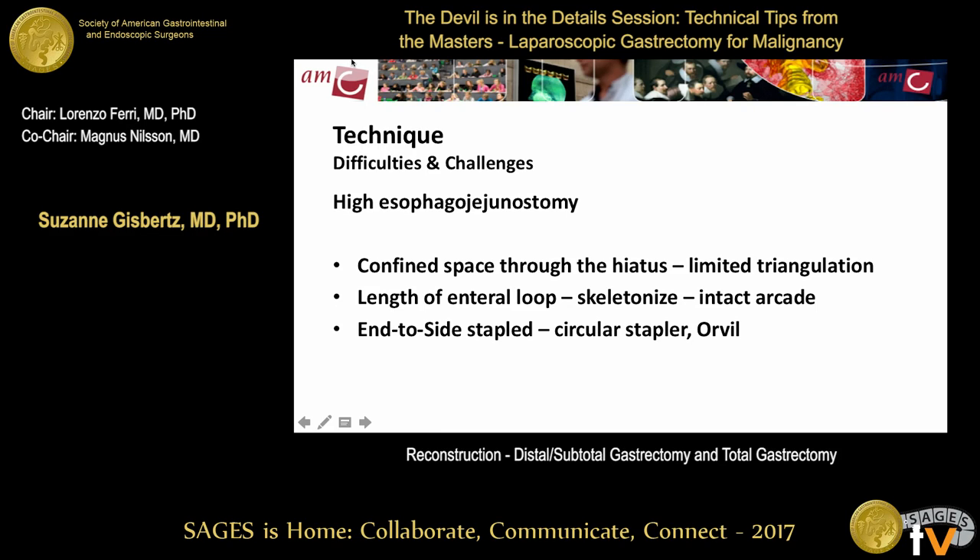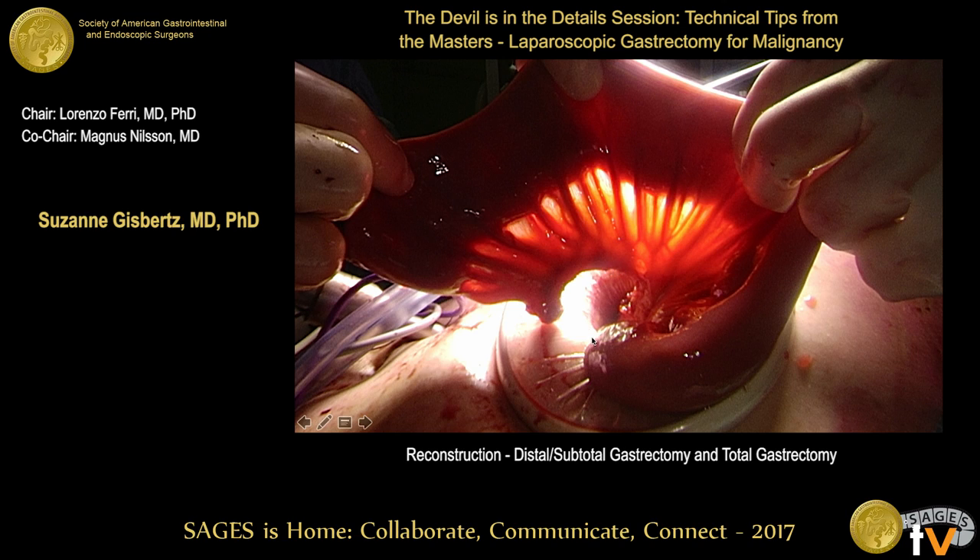For really high esophagojejunostomies, this technique can be difficult and challenging because you have to work through the small hiatus into a very confined space with limited triangulation. You need a long enteral loop, requiring skeletonization along the arcade of the small bowel, which must remain intact. For really high anastomoses, you can only use the OrVil or do it open — even through a thoracotomy. The arcade of the small bowel is shown beautifully intact with transillumination.